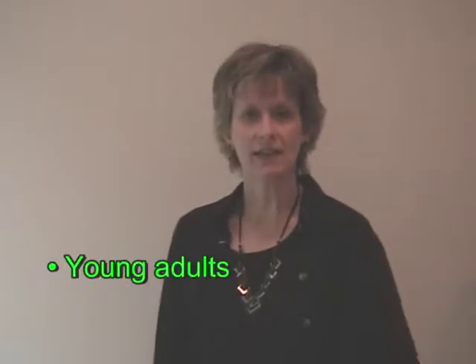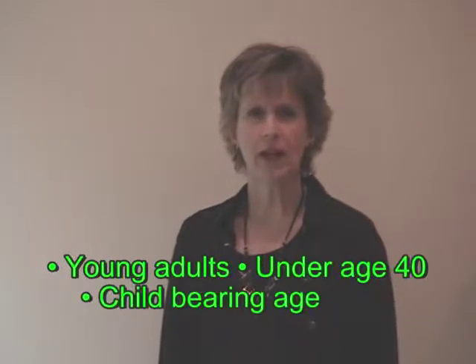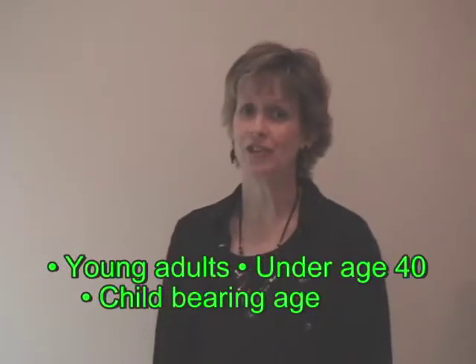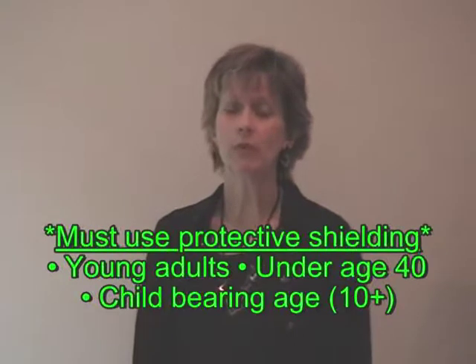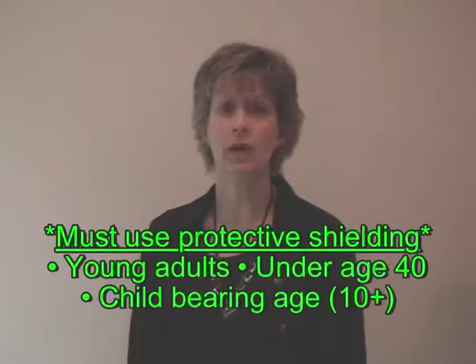First of all, any patient that is in an early adolescent stage, under the age of 40, childbearing age, which might be from age 10 up, it's very, very important that you use protective shielding, lead shielding over reproductive organs. That will be a constant requirement of any exam that you're going to position, and that's shielding the reproductive organs of childbearing age and younger people.